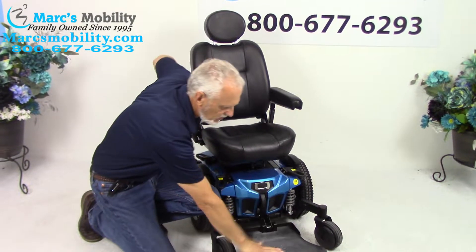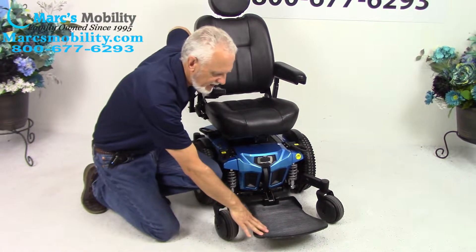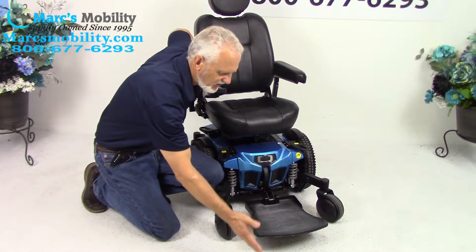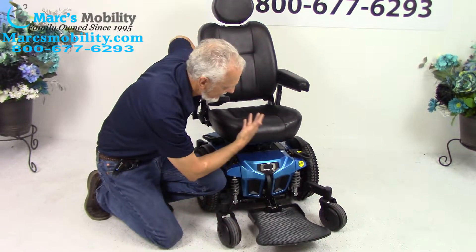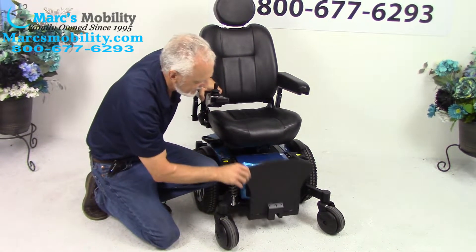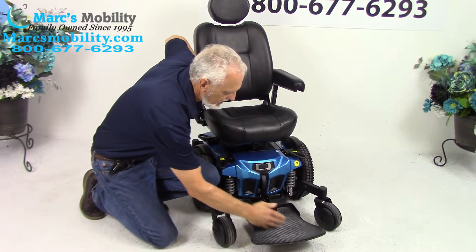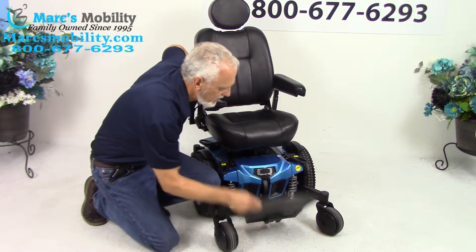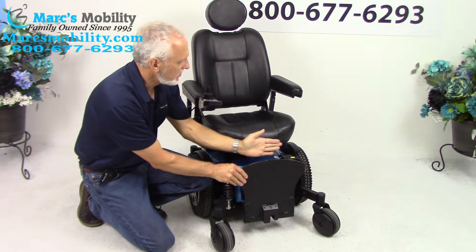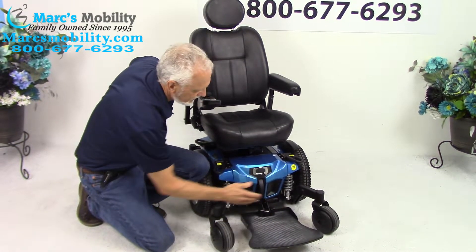This power chair has the extra large foot plate. If you don't want this foot plate because it's too big, let us know — we can switch it to a smaller one. But this person wanted a larger foot plate. It flips up if you need to exit the chair. The foot plate can also be moved back two inches; right now it's sitting as far forward, but you can move it in closer to the chair.